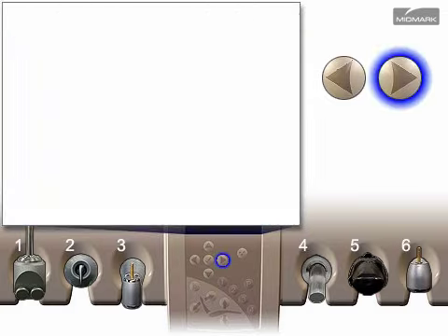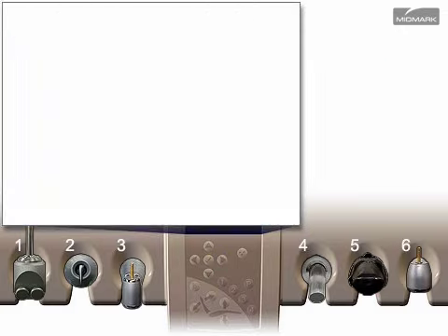A white screen is available to help you determine if obstructive dust or debris is present under the glass. Examine this screen for particles large enough to interfere with the display screens.